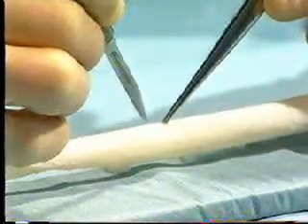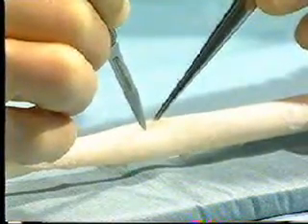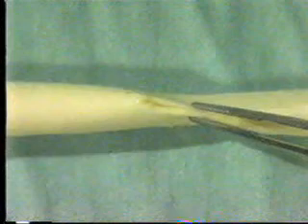A vein patch is the safest way to close an arteriotomy if there is the slightest risk that direct closure will produce narrowing. Start the exercise by lifting the adventitia of the artery, then with the blade pointing away from you, use a short stabbing motion with the scalpel. Using pot scissors, make an elliptical arteriotomy about three centimeters long. Inspect the internal surface of the vessel with care and excise the lips so that primary closure would produce an obvious stenosis. A defect such as this should never be closed using a primary suture technique — you can see here that closure would produce severe narrowing of the vessel.